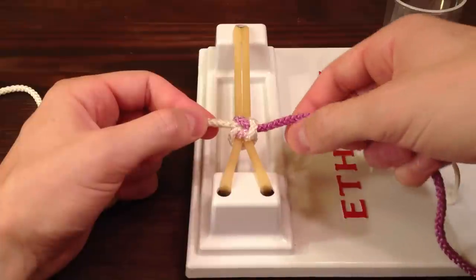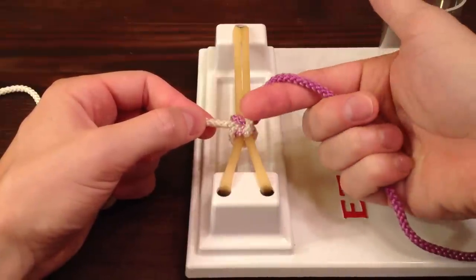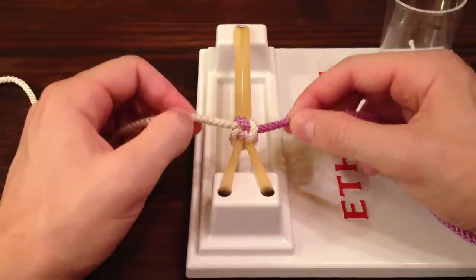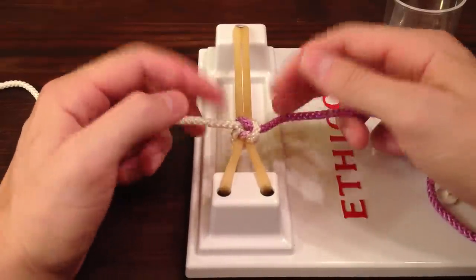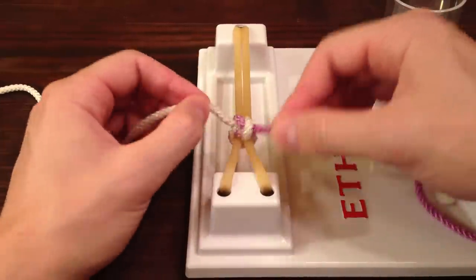Now we get a square knot because we tied two different knots — first we started with our thumb, then we started with our pointer finger. If we tied the same knot twice in a row, we'd get something called a granny knot, which is bad because they slip. Another way to tie a granny knot is if you pull your strings in the wrong directions. So when we tie the second square knot, I'm going to emphasize the directions that you should be pulling your strings.